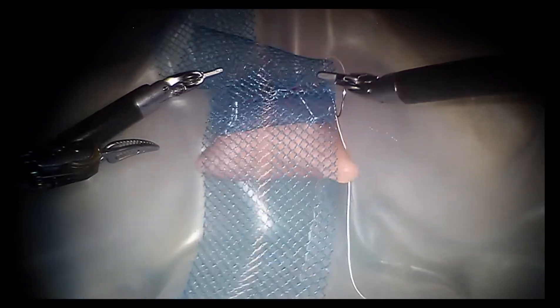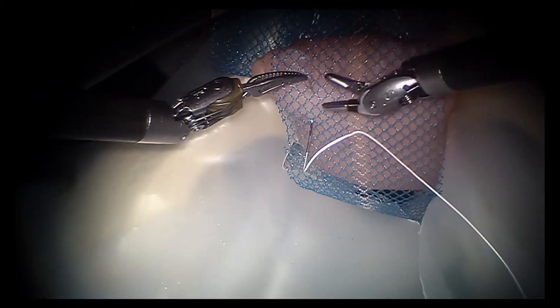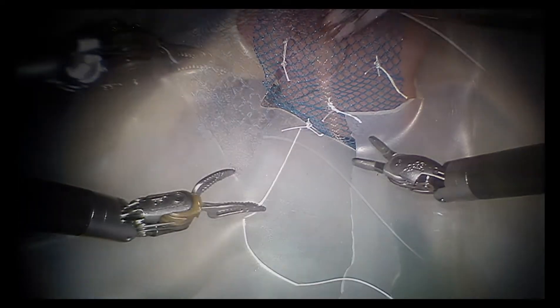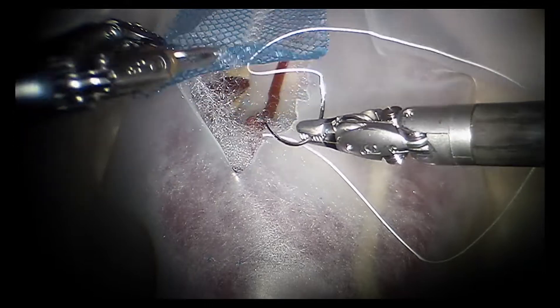With the assistance of the third arm, the vagina is deviated anteriorly to expose the posterior vaginal wall. Several interrupted sutures are placed on the posterior vaginal wall. The tension is then turned back to the sacrum, and the mesh is fixed to the anterior longitudinal ligament at the level of S1, S2.